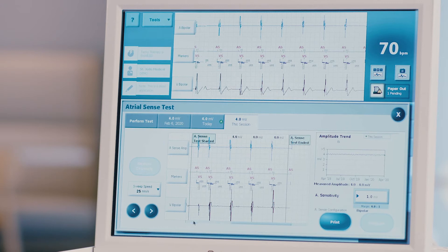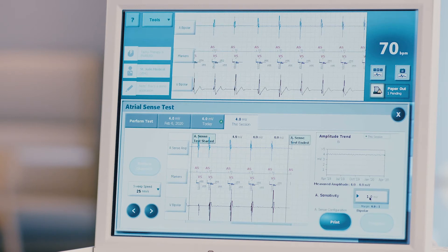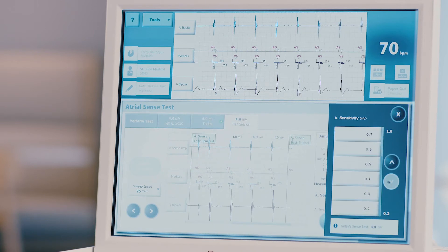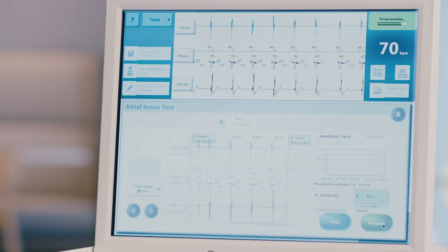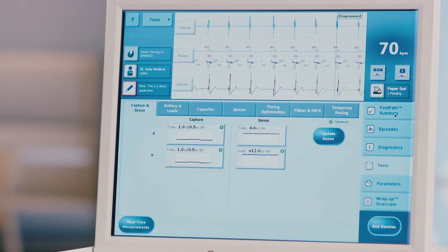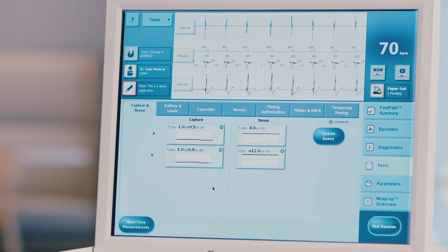After the test is completed, a freeze capture of the EGM will be displayed. Note any trend data provided on the right of the screen. Permanent programming changes can be made to each setting directly from this test results screen, only in the presence of a healthcare provider or certified Abbott employee. Choose the desired setting and click the green programmed button. Press X to close the screen and return to the test page. Any measurements obtained during testing will be recorded. Repeat this process for any necessary testing that was not automatically performed upon interrogation.